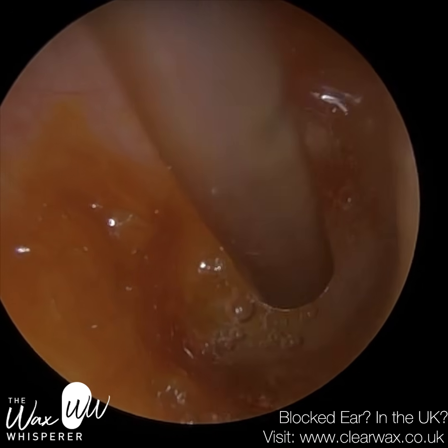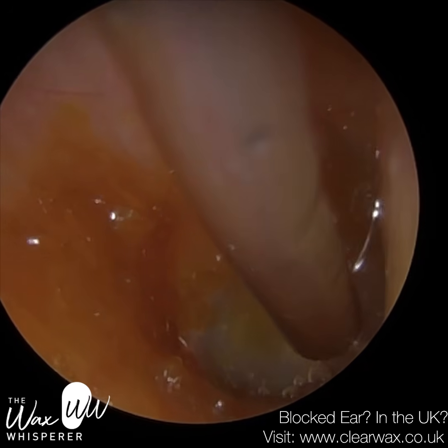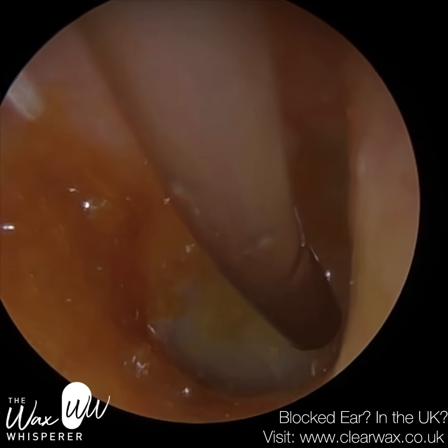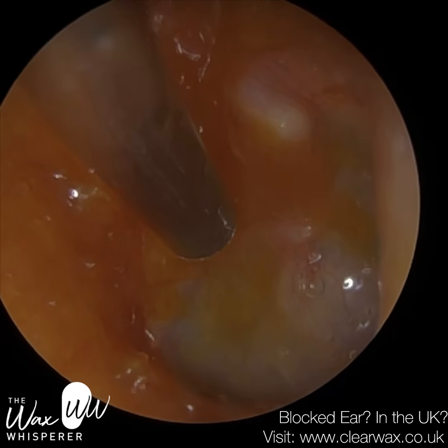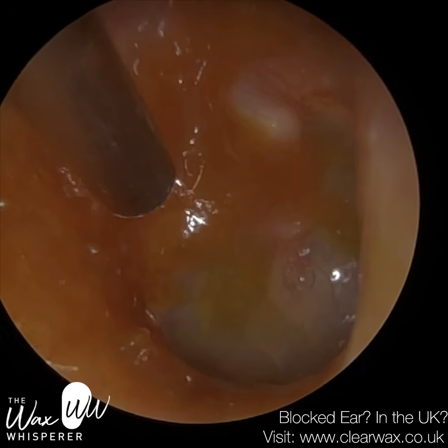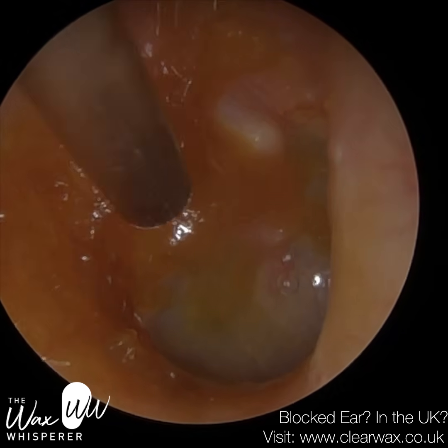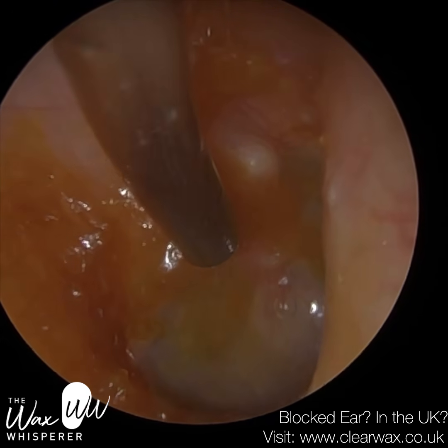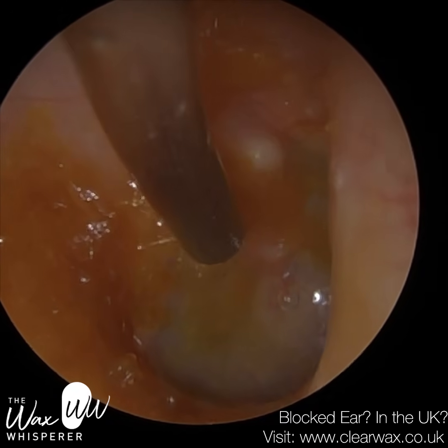Now, what will happen, because the occlusion has been removed, the skin that, as I mentioned earlier, lines the ear canal, the inner two thirds, also lines the eardrum. And from the center of the eardrum, this skin will start to move sideways. And as it moves sideways, the wax that's on the skin on the eardrum at the moment, in a few months, that skin will be probably halfway down the ear canal. So you'll have a fresh layer of skin on the eardrum. So the ear canal sheds itself from the center of the eardrum.